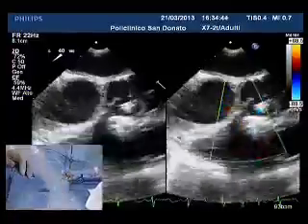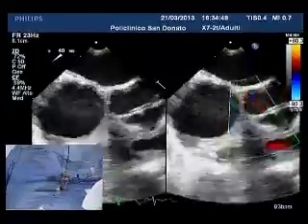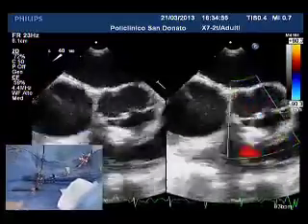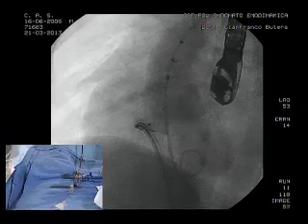We'll do one more angio before. Show them fluoro, please. Kamal. Show them fluoro. Looks very nice. I was skeptical a little bit. Yeah, there you go. We're going to do a finish cine now. I thought the right coronary was more involved. That looks good. So I think we're pretty happy, Joachim, with the position and with the location, with everything.